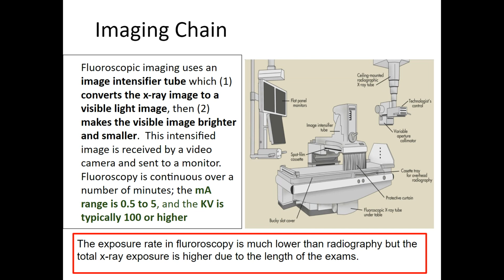You know, when Merrill's calls for an RAO, that's supposed to be what? 45 degrees? How do you know it's 45 degrees? The radiologist can actually move the patient. They'll wear their lead glove, or they'll instruct the patient to turn, stop, just when the pyloric antrum opens or whatever they're looking for in just the right spot. So it's a great tool. It's kind of the x-ray before the x-ray. But then again, you're moving the patient while the radiation is going. So there's a lot of radiation involved here.